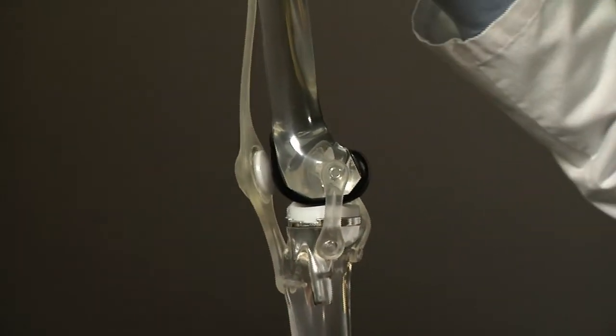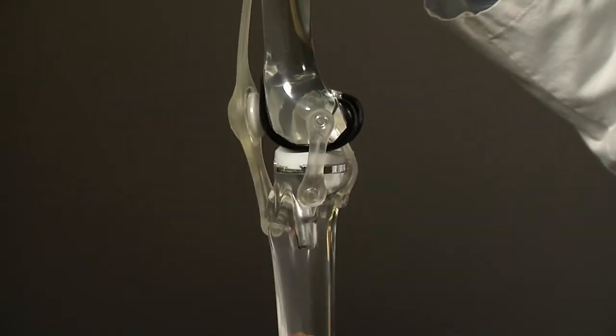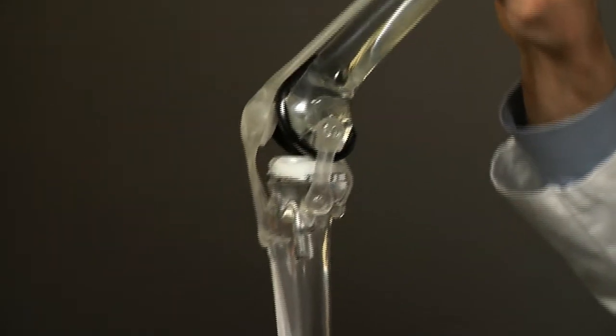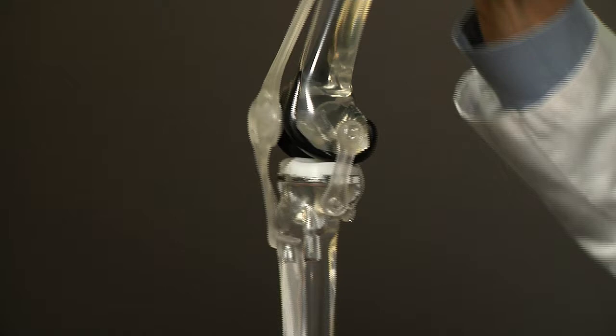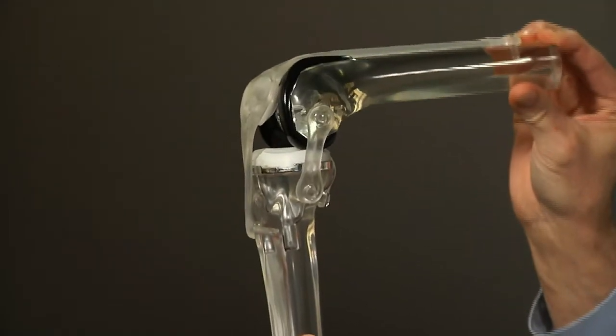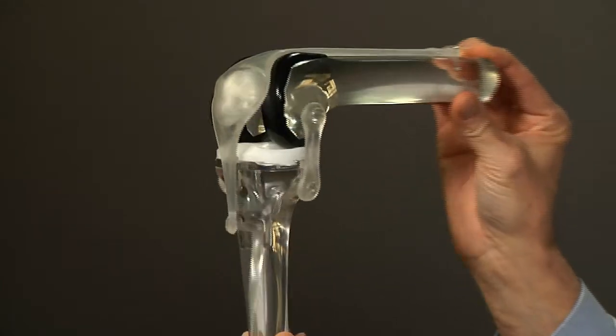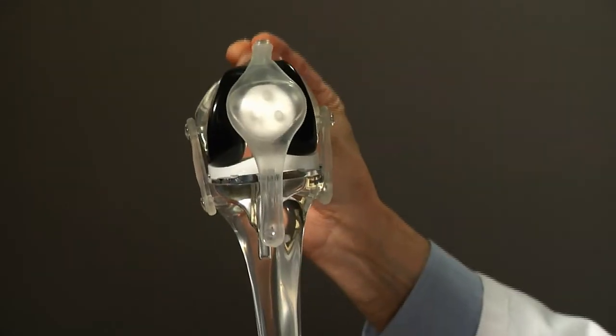As you stand, both bones are straight. Walking would be cycling through this range of motion, and when you go to sit down in a chair or a deep knee bend in that position.